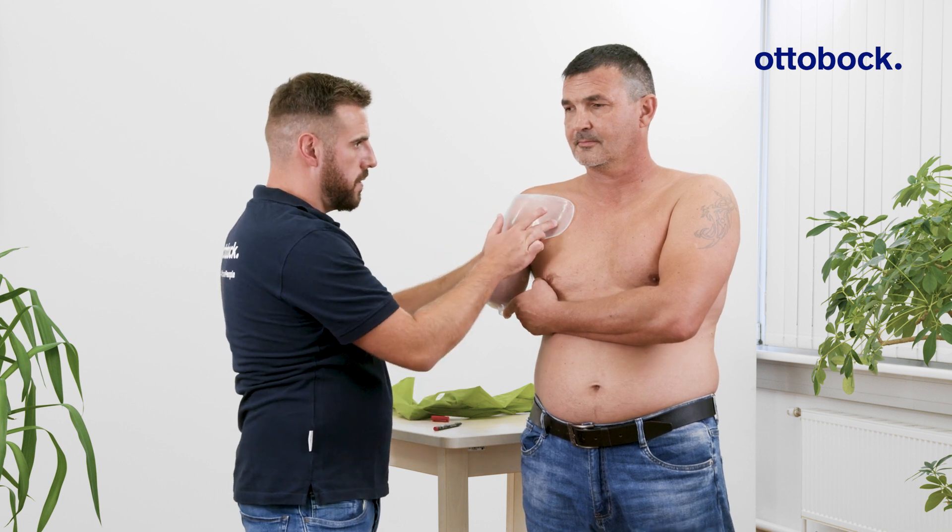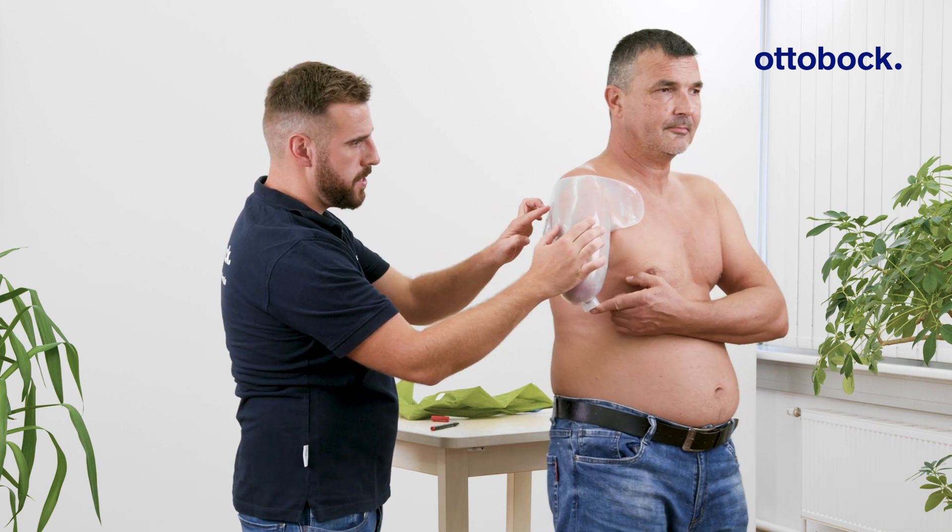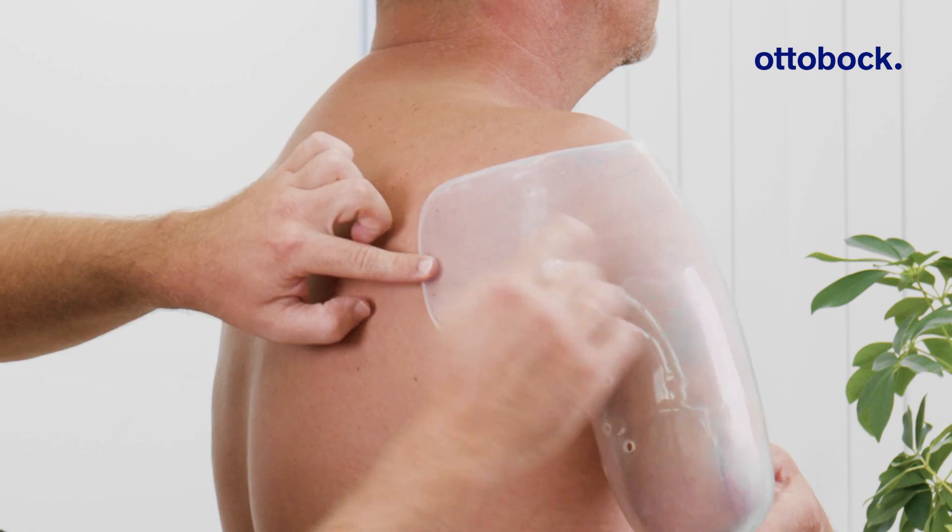Be sure that the clavicle, acromion, and scapular spine remain free and are not enclosed by the socket.